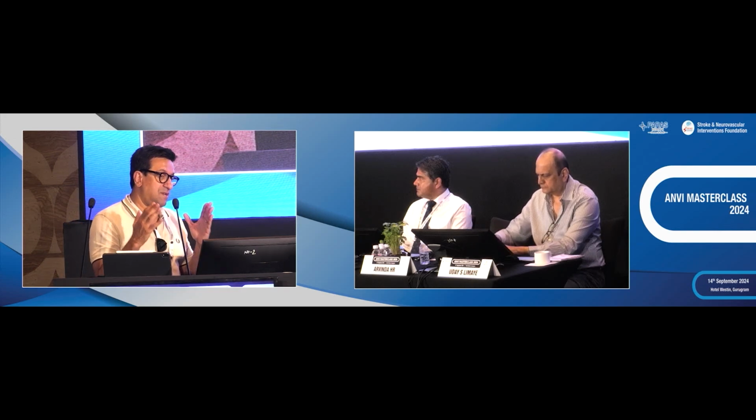Sizing for WEB, my technique, and I've been doing it for years now, is I do the 2 planes. I don't need the chart. I add the 2 planes up, divide by 2, plus 1, and then I decide the height. That height decision will depend on my access and whether it's an old patient, but I try to fill as much as I can.